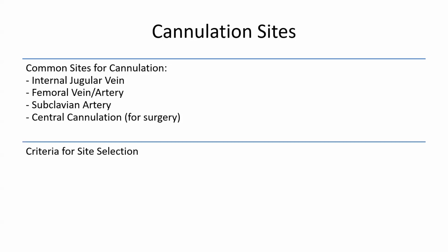So for drainage of blood, we usually use the femoral vein, where we put the cannula right up, which goes right up into the hepatic portion of the IVC. The tip is in the IVC-RA junction, and we are draining to the circuit, and then from the pump and oxygenator we give back the blood. The return blood is usually given into the internal jugular vein.